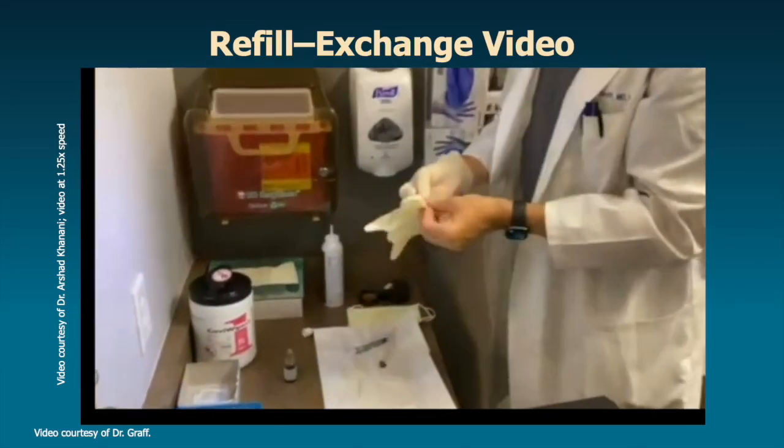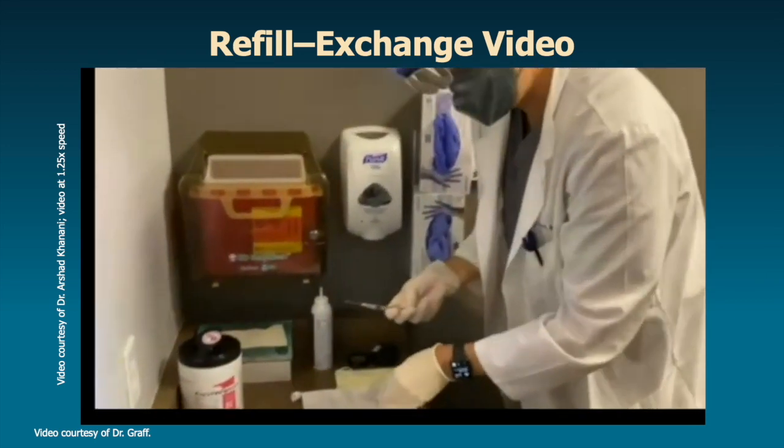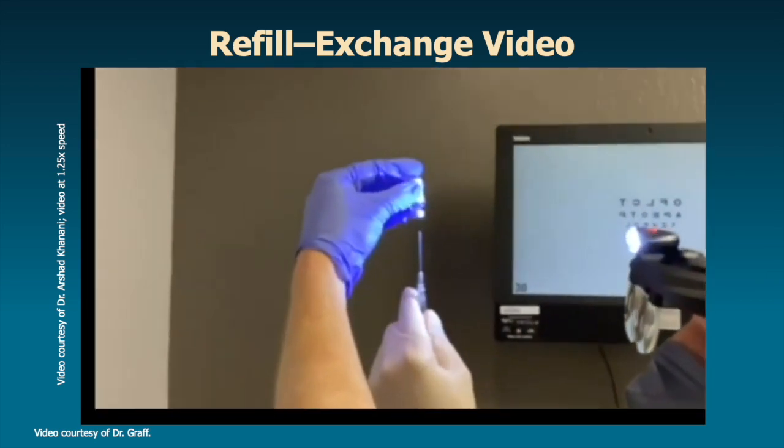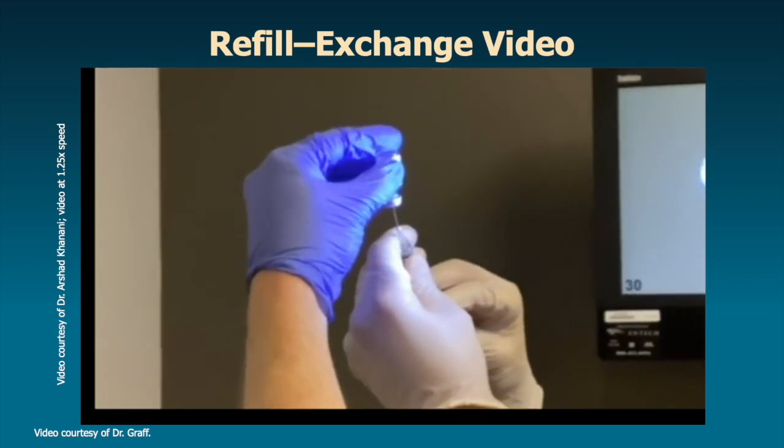Now I'll show one more. This is played at 1.5 speed and after doing a handful of these injections you can kind of see every step going forward. The actual procedure is really only about 60 to 90 seconds long.